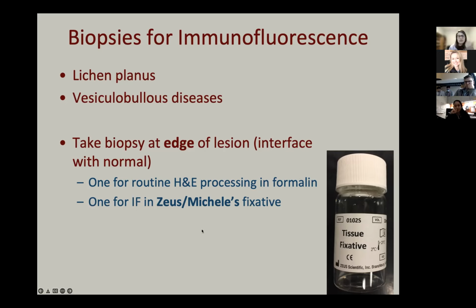I know some of you may have had the opportunity to communicate with us about these cases, but we do have Zeus or Michel's fixative available for you. If you see a patient in clinic or in the OR that you might need this fixative for, we can send some to you, and you can just put it directly in there and we will process it for immunofluorescence. Or you can send it fresh, no formalin, no saline, no nothing, just fresh, and we can place it in the fixative and do immunofluorescence. So in any case, it'll get done as long as you let us know what you need.